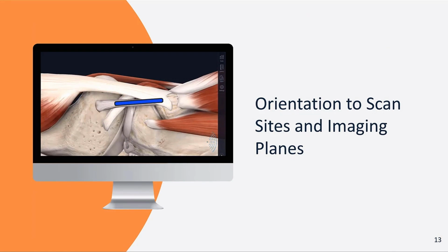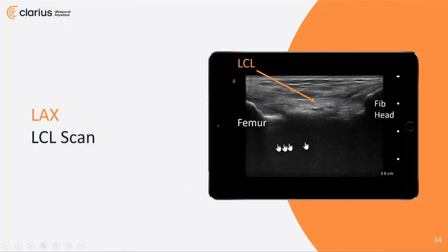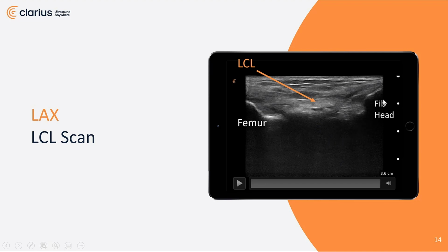And so we move on to evaluating just the lateral collateral ligament. We're looking for signs of inflammation to identify where along that ligament the injury is most likely. When the body is irritated, when something is torn, the body does create fluid in the region, and that fluid can show up on ultrasound as darkness. So it is literally as simple as placing the probe over the area of pain and looking for darkness. So we're going to now take a look at the actual structure of the lateral collateral ligament, remembering this is the fibular head, this is the femur, this is the popliteus tendon.